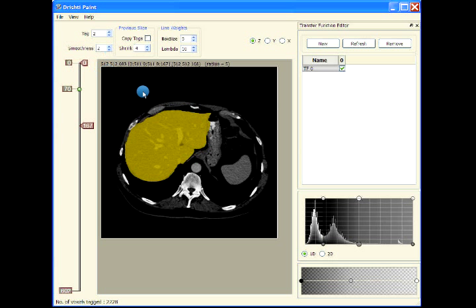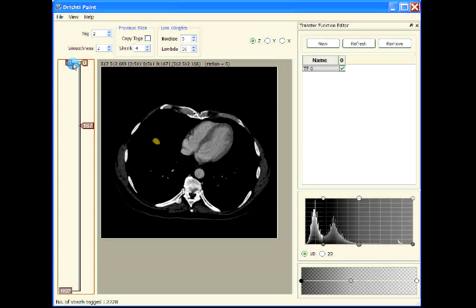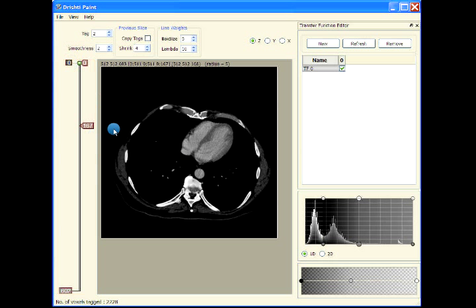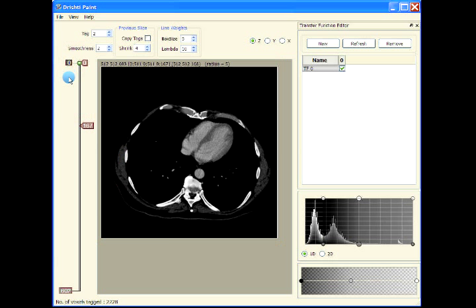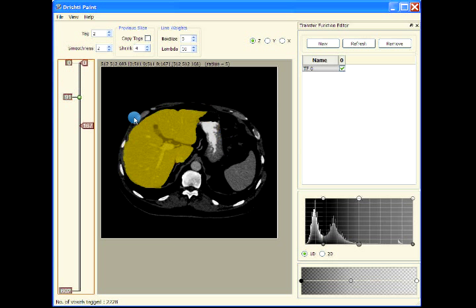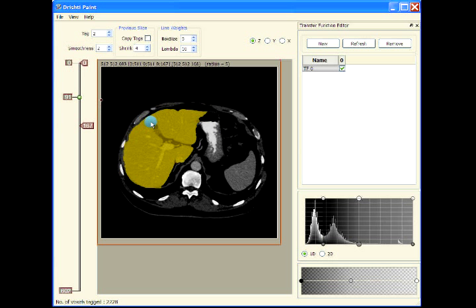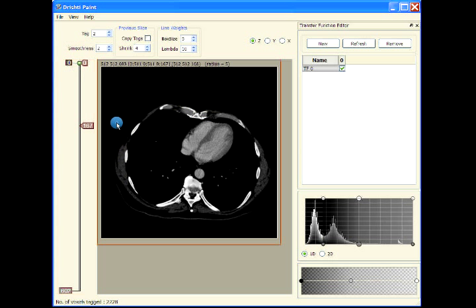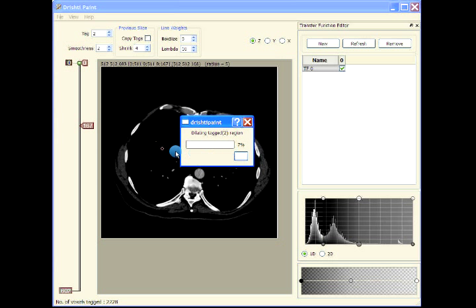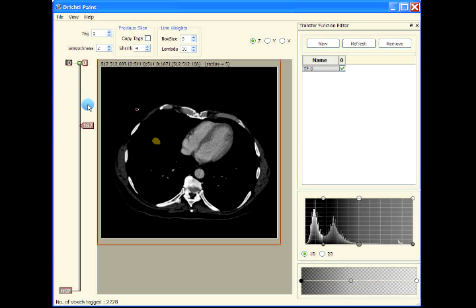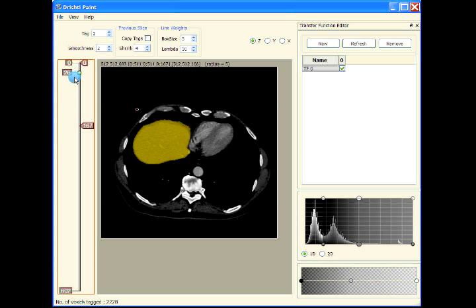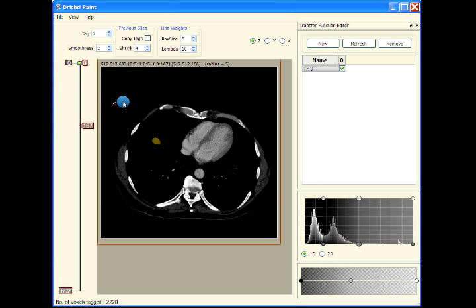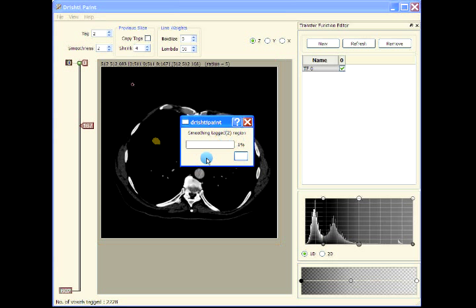I think we are almost done here. Press Escape to remove all the extra bits. Let's apply some smoothing. Let's dilate it a bit and then apply smoothing. Control-D, we're dilating it just a bit, and we'll apply smoothing.